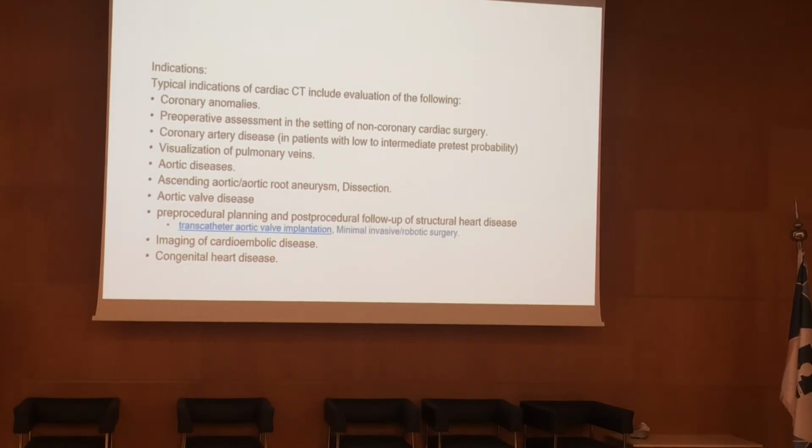So what are the indications? Why do we do cardiac CT? Okay, excellent. So check the arteries. Is there any coronary anomaly? Do you know any coronary anomalies?